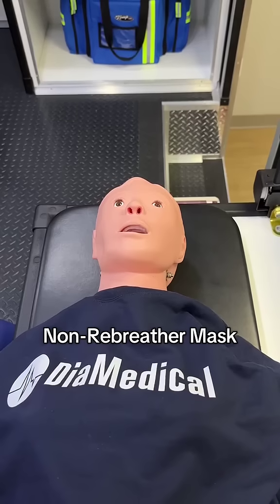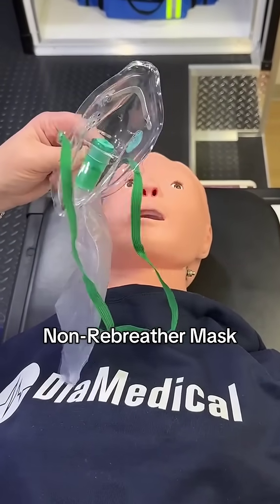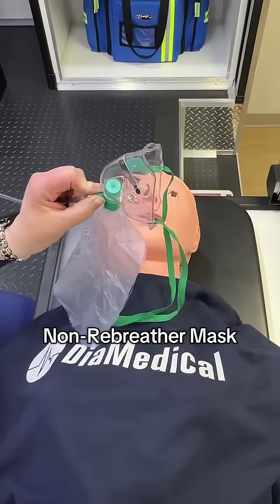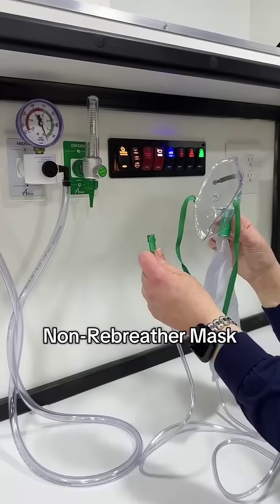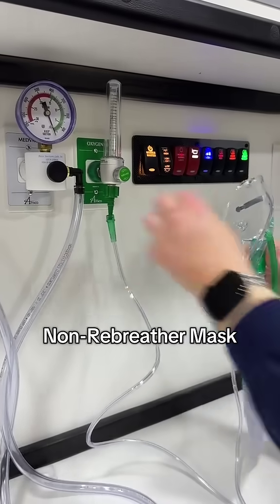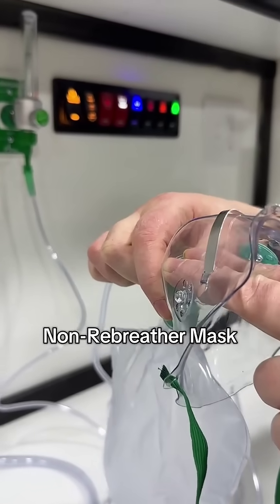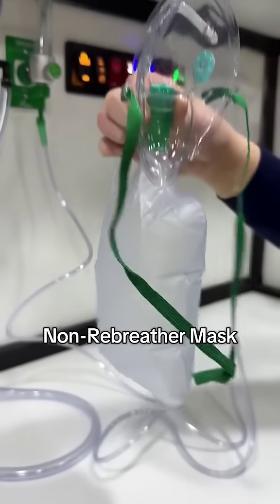Next, the non-rebreather mask. This is going to cover the nose and mouth, and it has a reservoir bag attached. It provides up to 100% oxygen concentration by preventing room air from mixing in. It's used on patients who need a significant boost in oxygen but are still breathing adequately. Fill the reservoir bag with oxygen first, and make sure that bag never goes flat while it's on your patient.